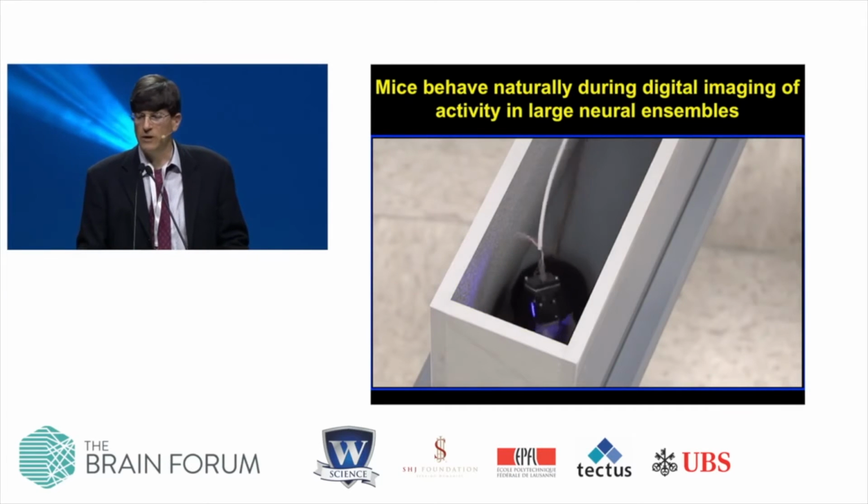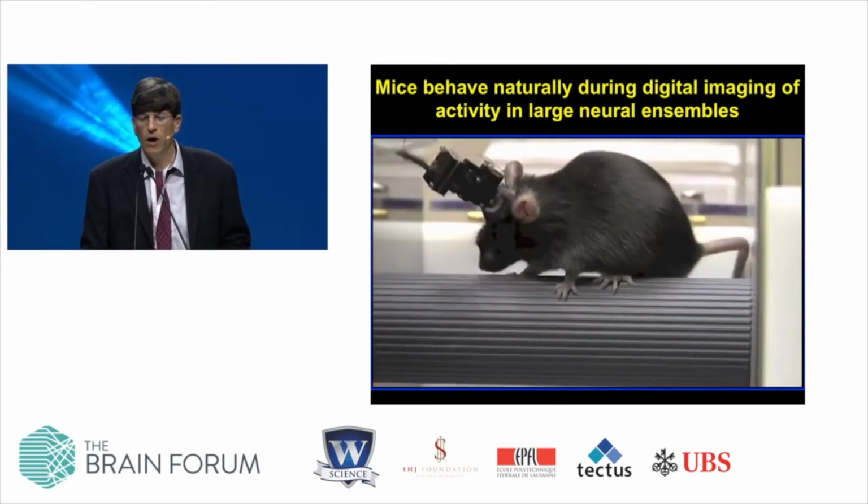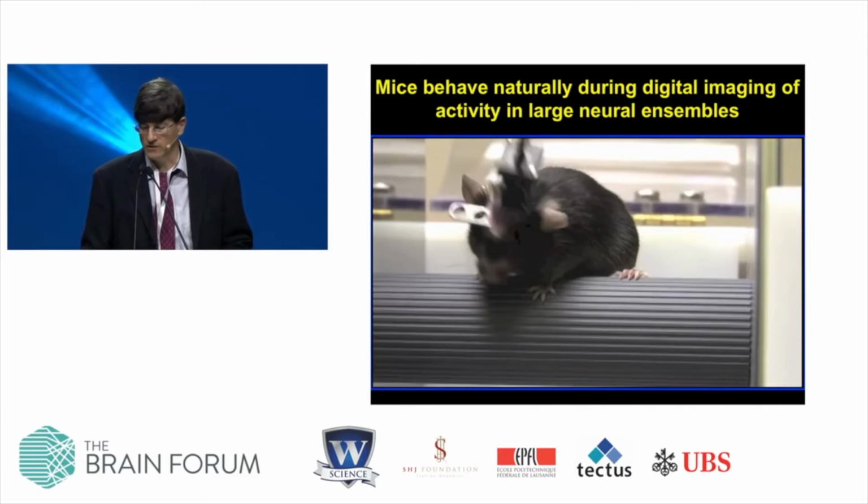Now here's what it looks like when a mouse is wearing the microscope. The animal can behave naturally, it can move at high speeds. Meanwhile, we're streaming digital brain imaging data right into the USB port. So this is our computer mouse, if you will.